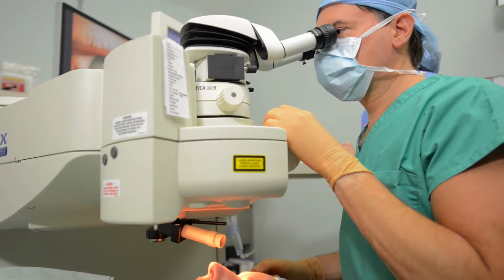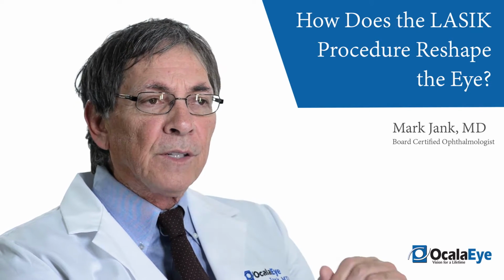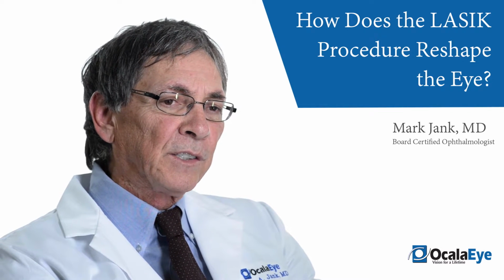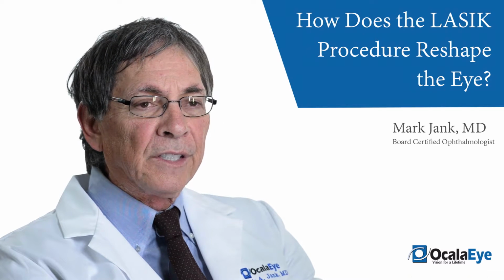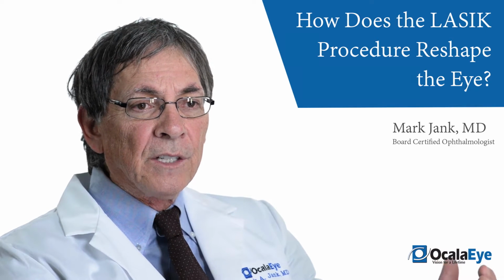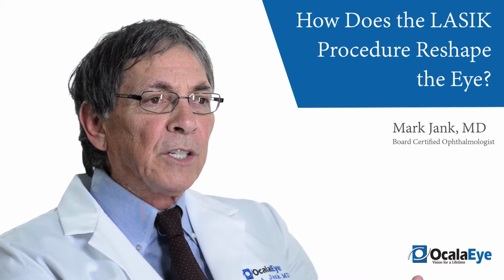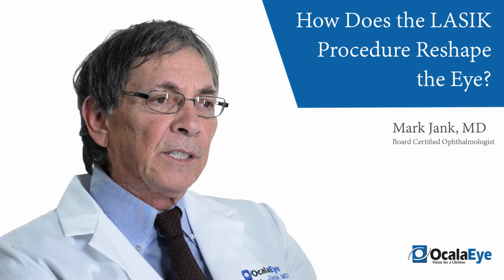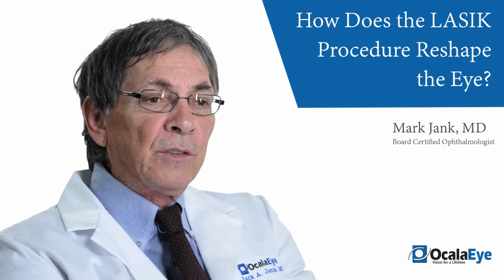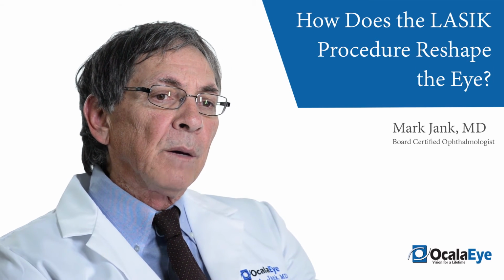The duration of laser treatment depends on the amount of refractive error, or the amount of focusing error that a patient has. But in general, it can be as little as 10 seconds and as long as a minute and a half. After the laser is completed, which again is painless, the flap is laid back down. And then the doctor does a few things to make sure that the flap is situating itself properly and perfectly. And then that's it. The patient returns to the relaxation room and then is looked at one more time by the physician before going home.